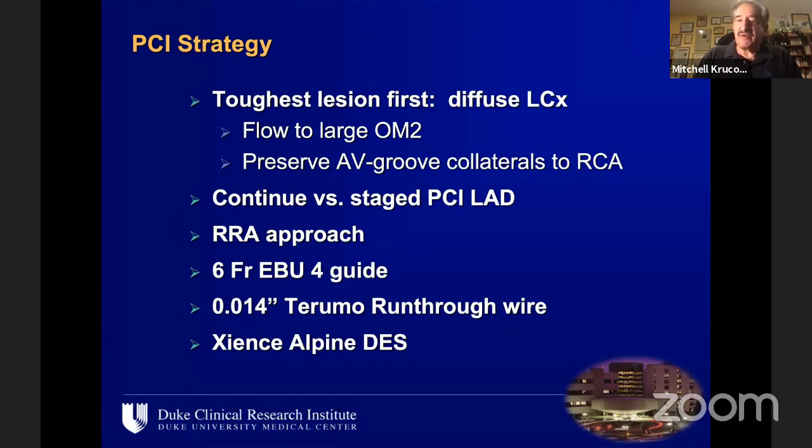At his age, his renal function was fairly well preserved. On the other hand, if the circumflex became very complex, used a lot of radiation and a lot of contrast, we would stage the LAD procedure. We worked from the right radial approach.